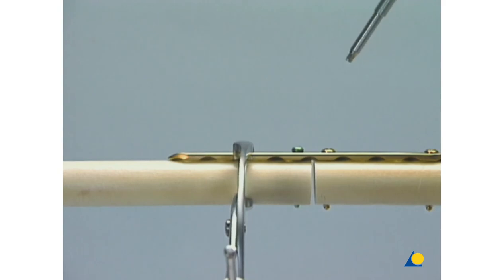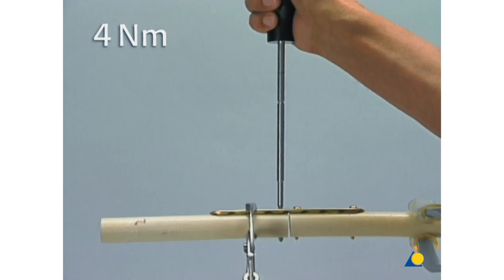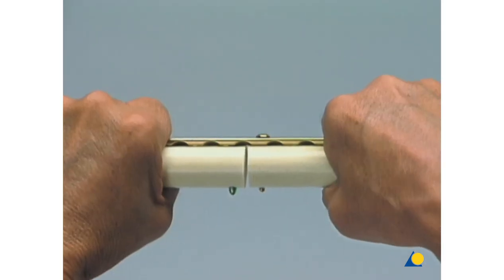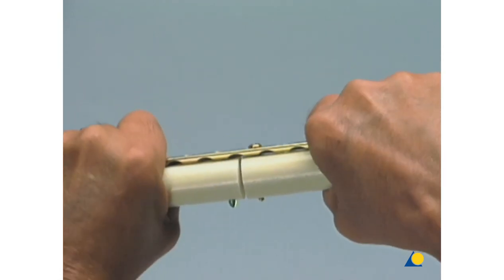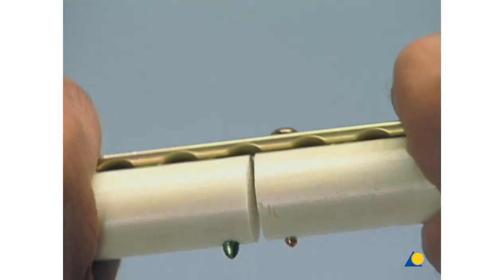The torque-limiting screwdriver is used for the final tightening. To compare the purchase of the two screw types, the model is held with both hands close to the gap and bending and rotational movements are begun, to observe which side begins to loosen first.